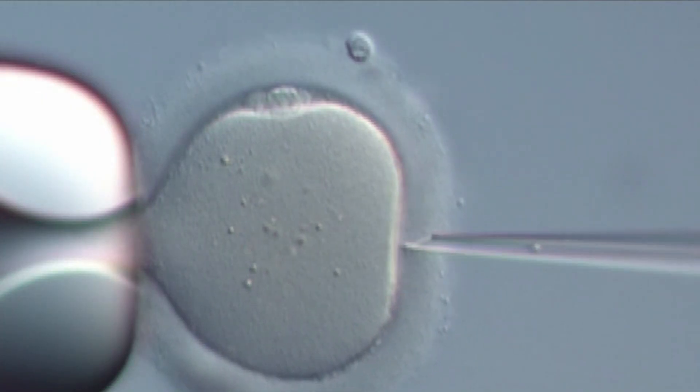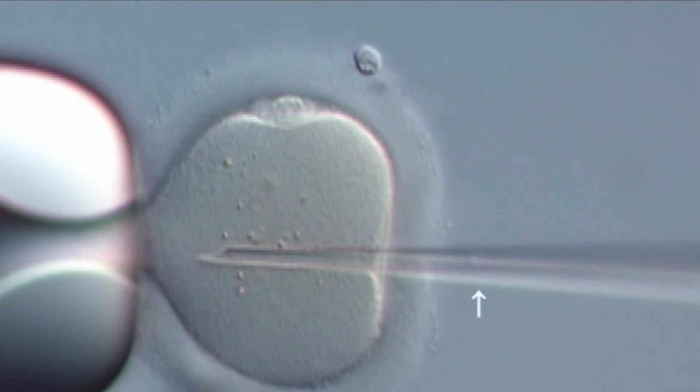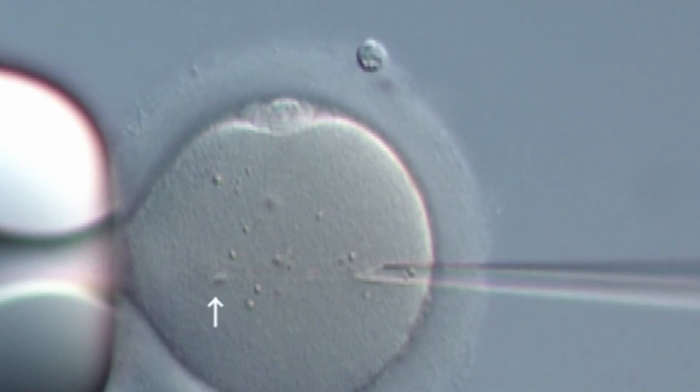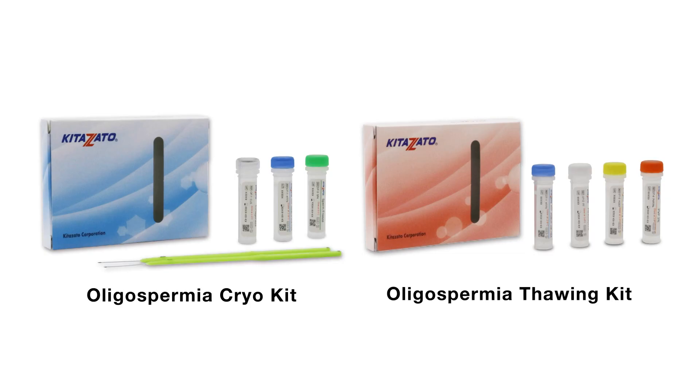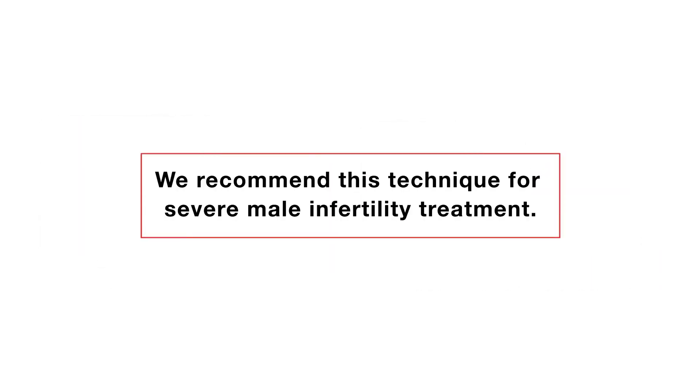It is all for the collection and cryopreservation of oligospermia. Kitazato offers products to follow the method described in this video. We recommend this technique for severe male infertility treatment. Thank you.